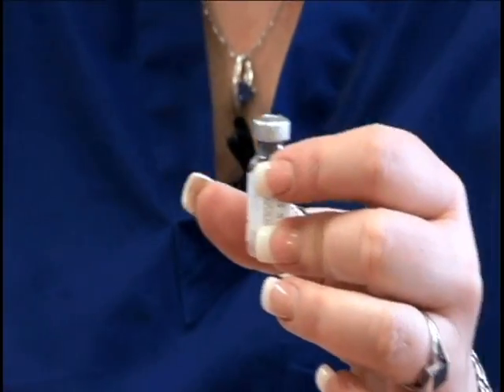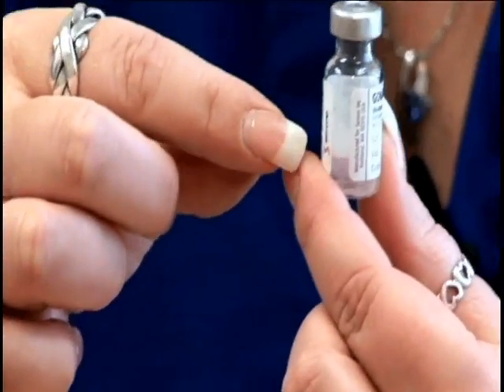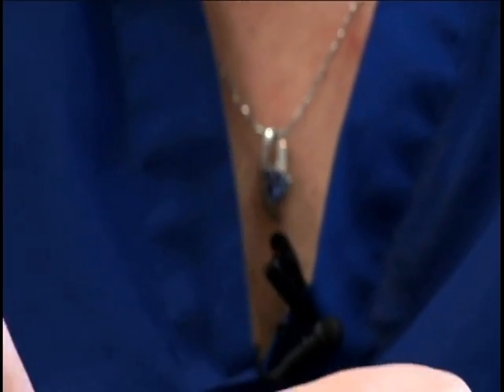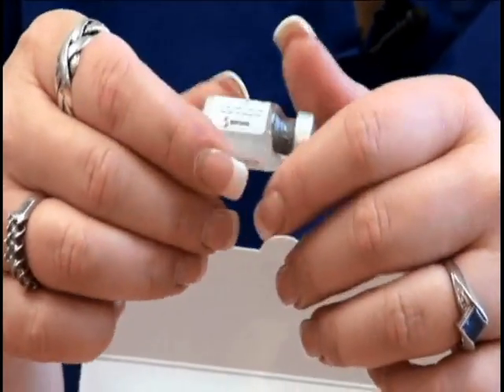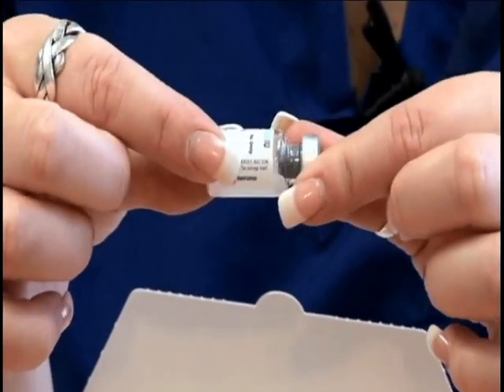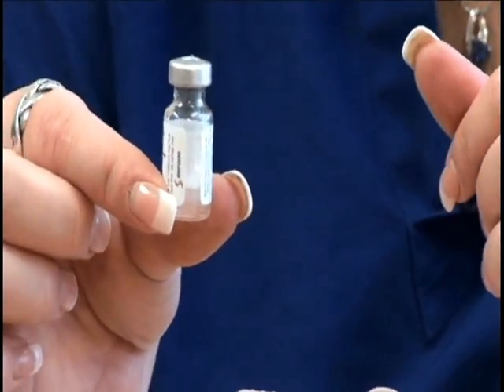This is a powder, so you want to make sure that all of the powder has been liquefied. If you notice that there's still powder in the vial, you want to turn it to its side and just roll it around until the medication is mixed. We recommend that you don't shake it because you'll get lots of bubbles and it'll be difficult to pull out the medication.